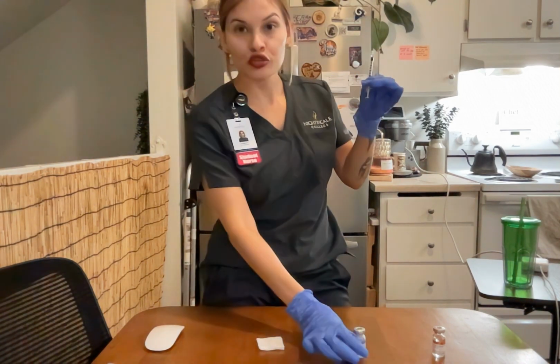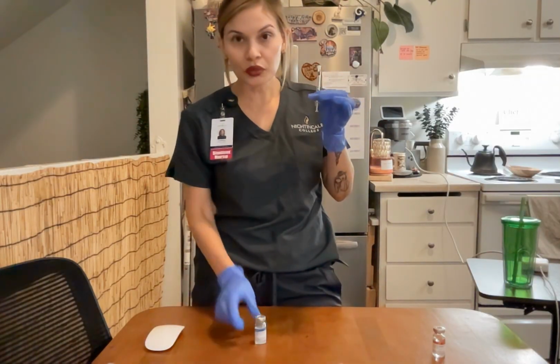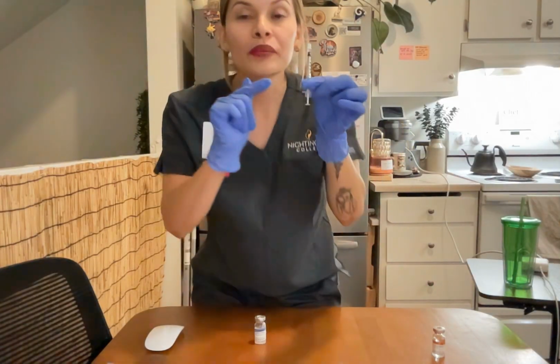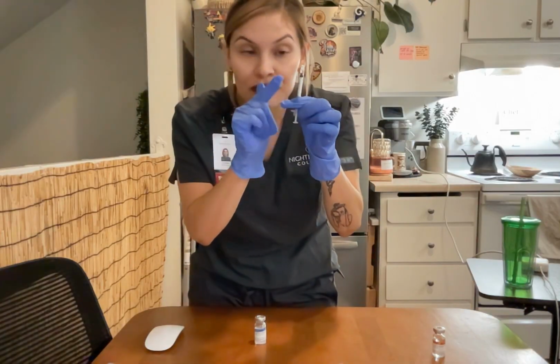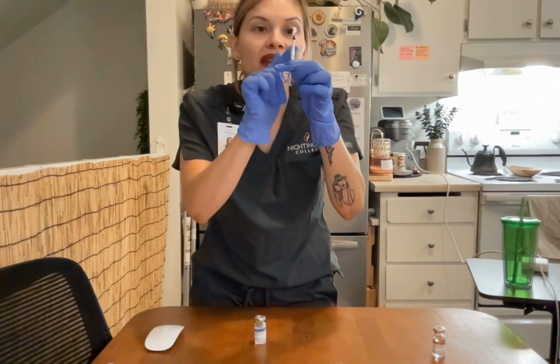Now, prior to filling the syringe with the NPH, I'm going to point to the total combined volume of insulin, which is 12 units. So I make sure that I see the 12 units in my syringe.